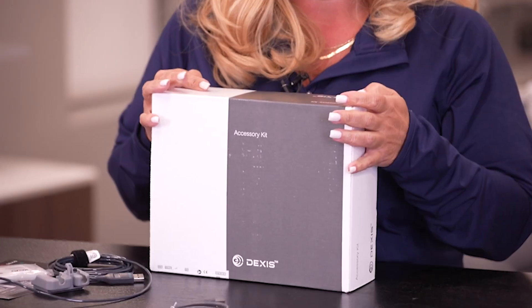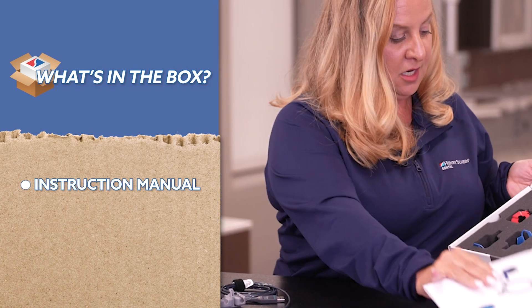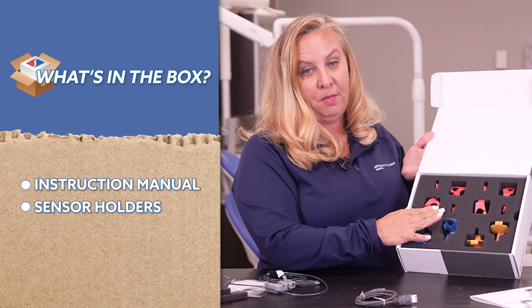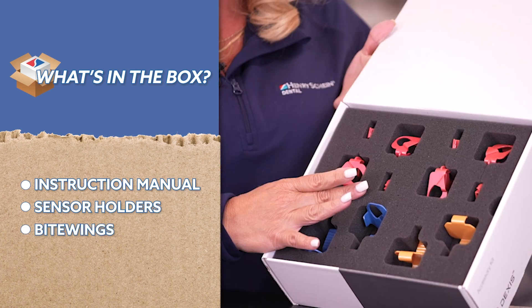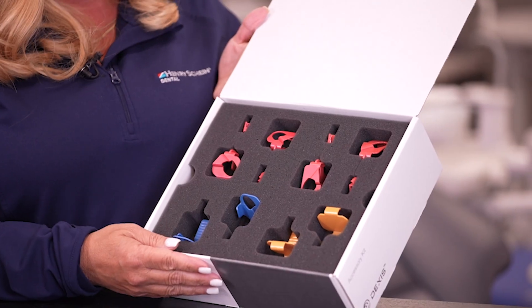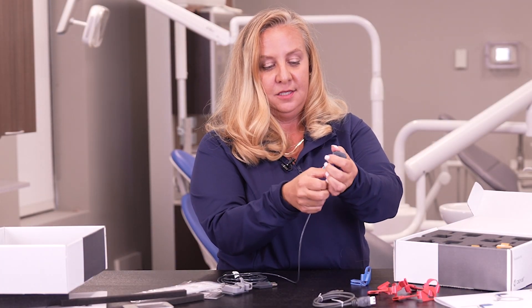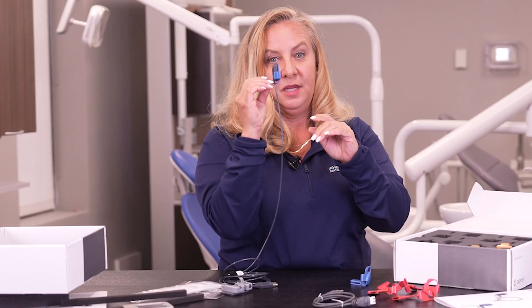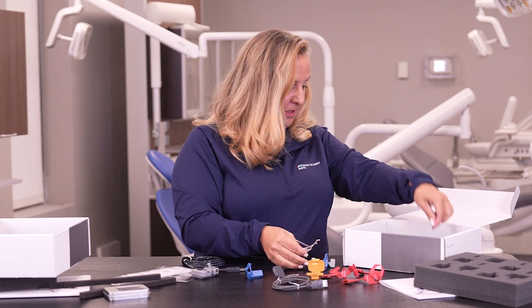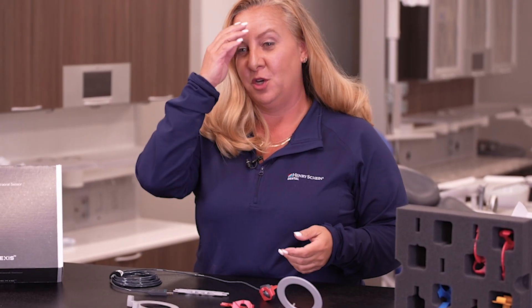The next is the accessory box, which is our ring system. You have the instructions, your posterior and anterior rings, and all your bite wings — whether vertical or horizontal. They're color coded like the universal ring system we know in offices today. The sensors mount right into place, and then you have your arms and rings for attachments. Anybody who's been in the dental field is very familiar with the ring system.